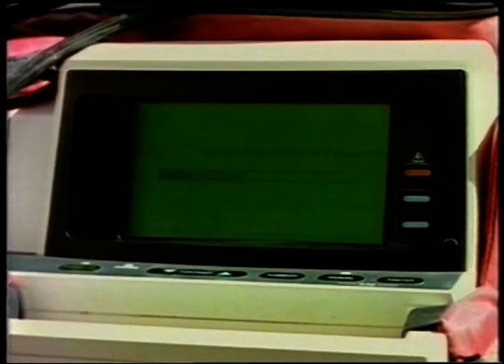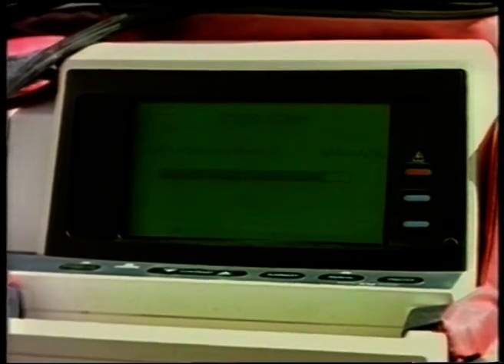If a shock is indicated, the LIFEPAK 300 will automatically charge to 200 joules. As you can see, the display's charge bar and accompanying ramp-up tone indicate the degree of charge. When fully charged, you will hear push to shock and a continuous tone. The top display button is labeled push to shock.